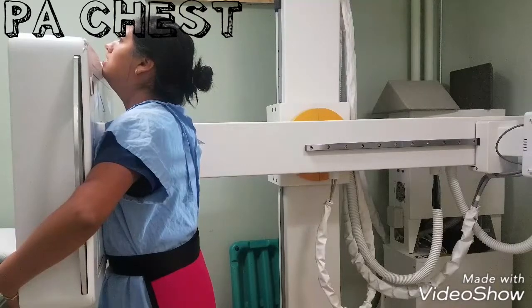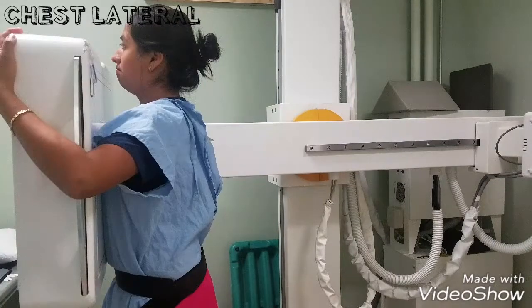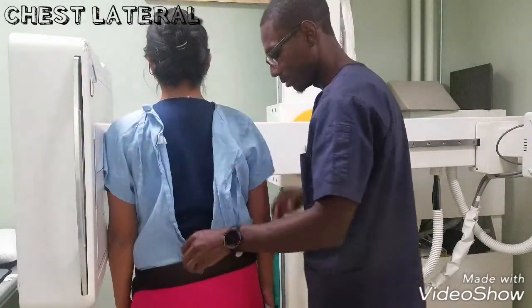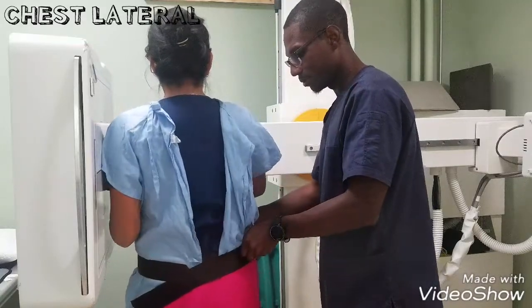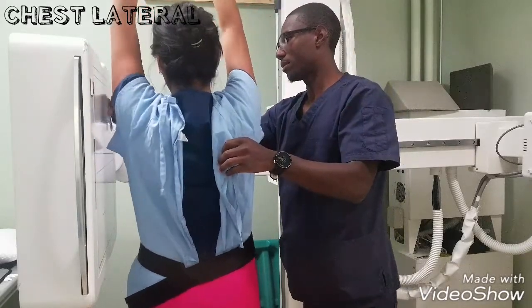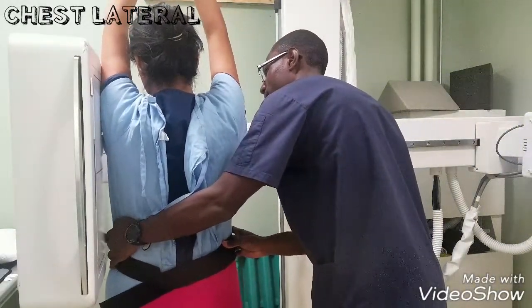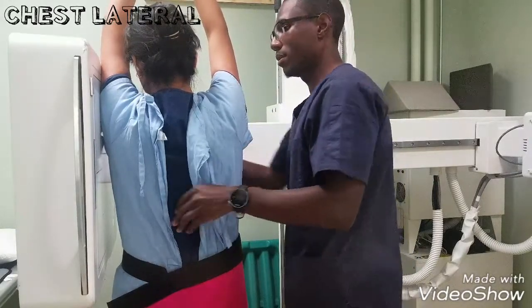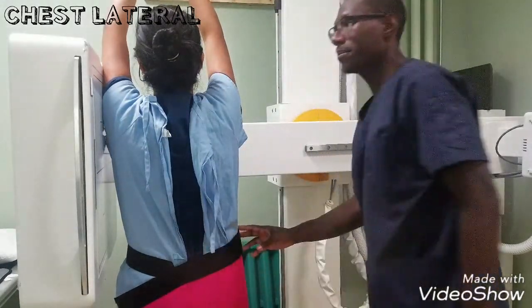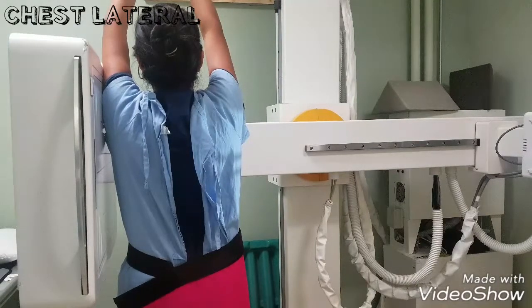Take a deep breath in, hold your breath, breathe. Step to the left. Take a deep breath in, hold your breath, breathe.